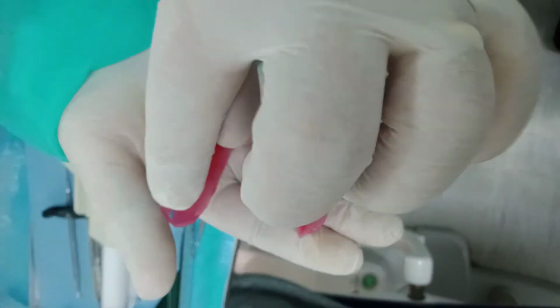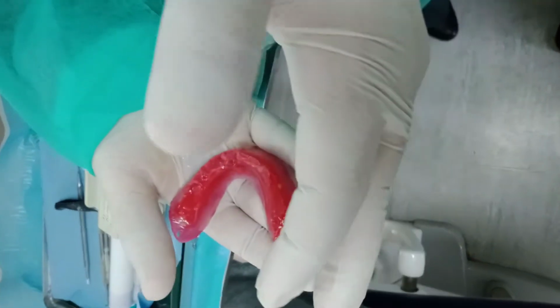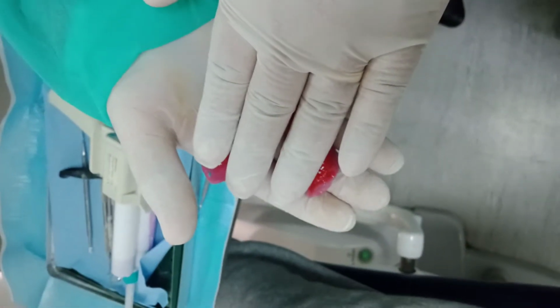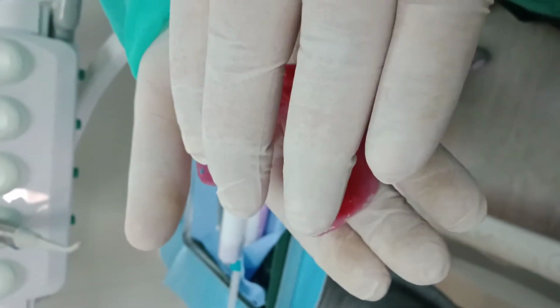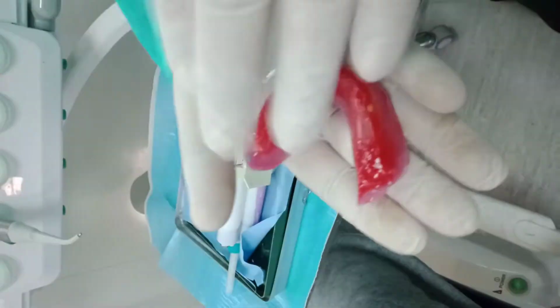So what will happen? The rubber will go into the indentation in case it dislodges from place, but the adhesive will keep it in place. Now the rubber is here, the other upper teeth are biting in the rubber, so I'll have the indentations of teeth, so the technician will know how to orient it.